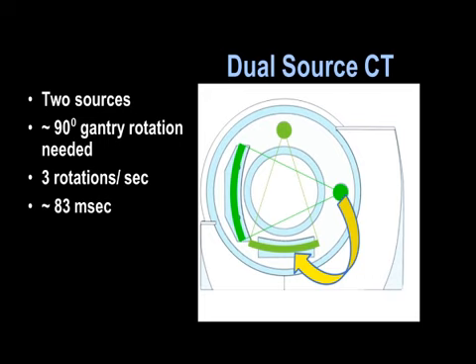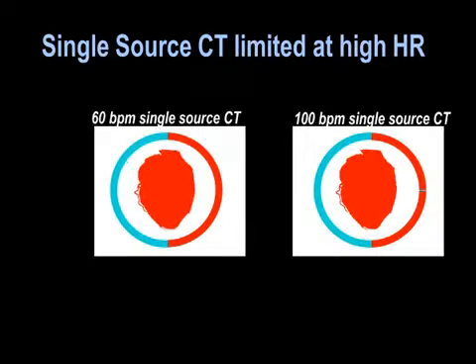For ILD studies and so on, we used to have to intubate these kids, and we used to have to do a respiratory pause, and it was quite complicated. But on this scanner, the dual source Siemens scanner, we don't need to do that anymore because you can get high-res cuts in a breathing infant, even if they're breathing 30 or 40 times a minute. So it really is some nice technology here.